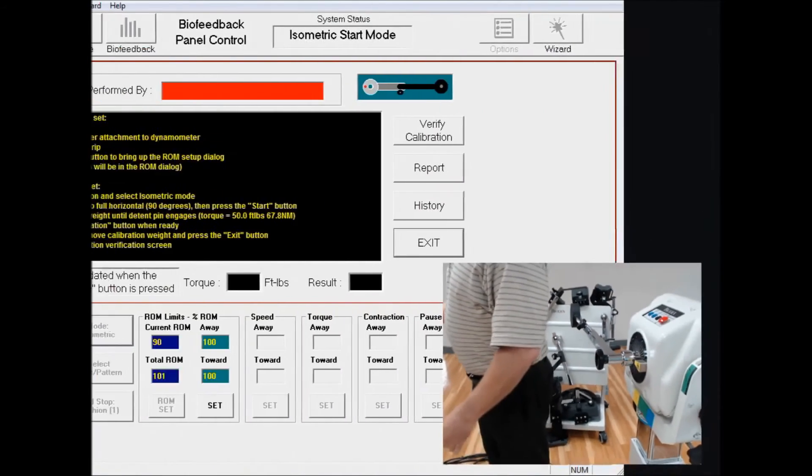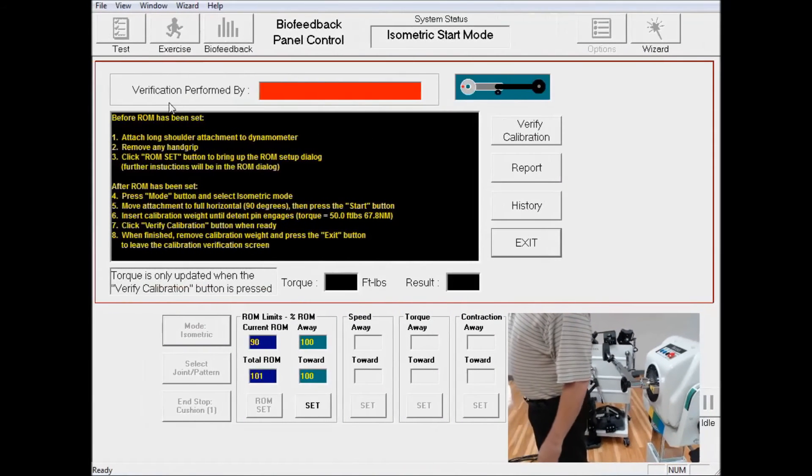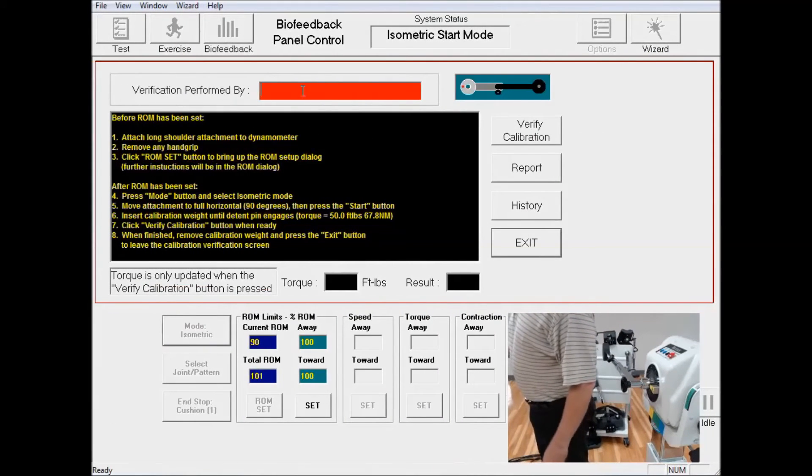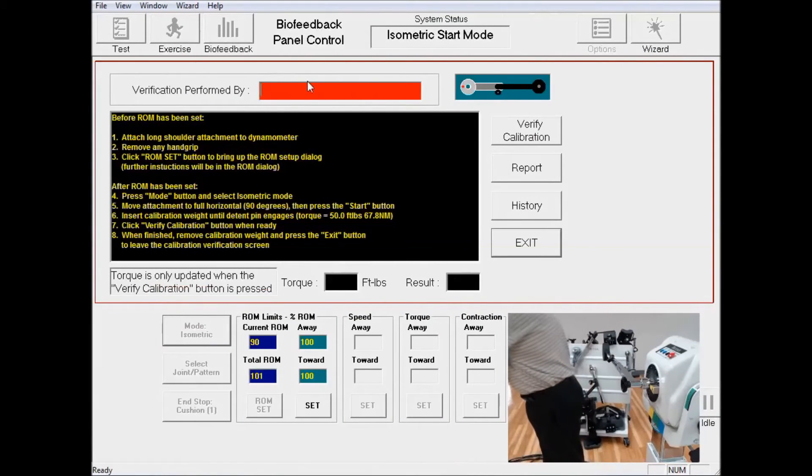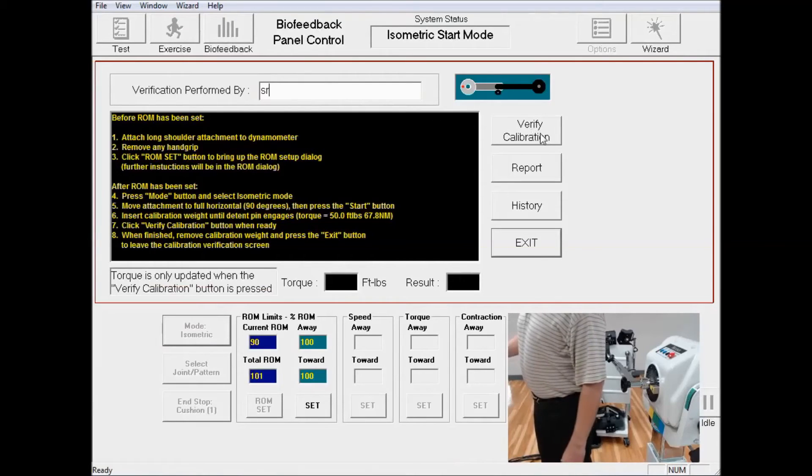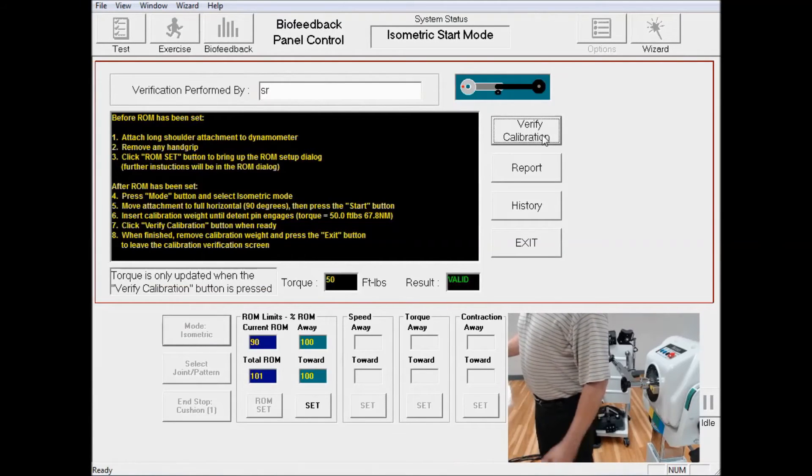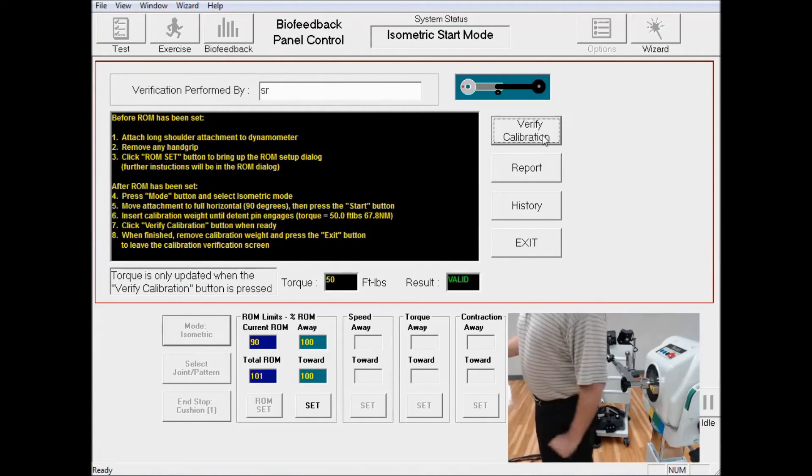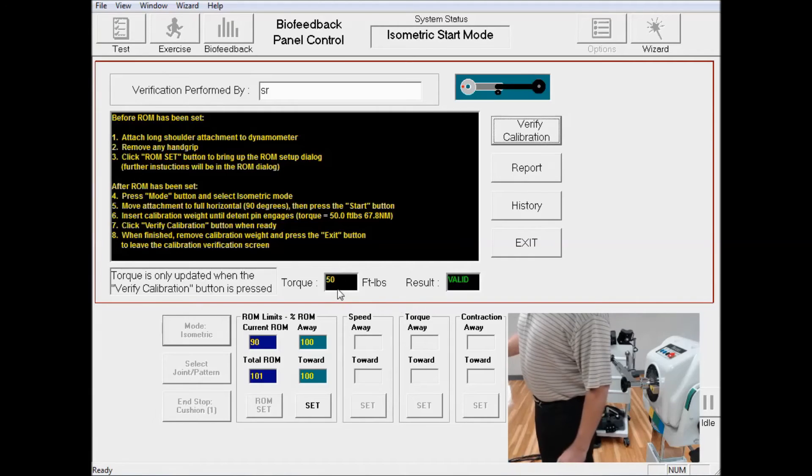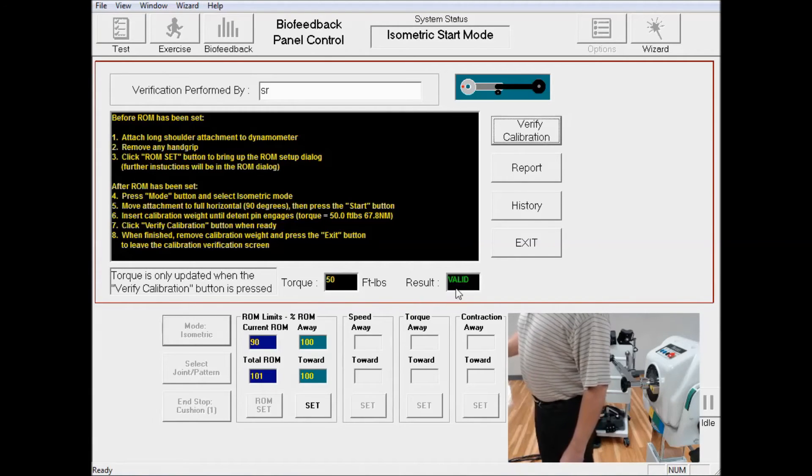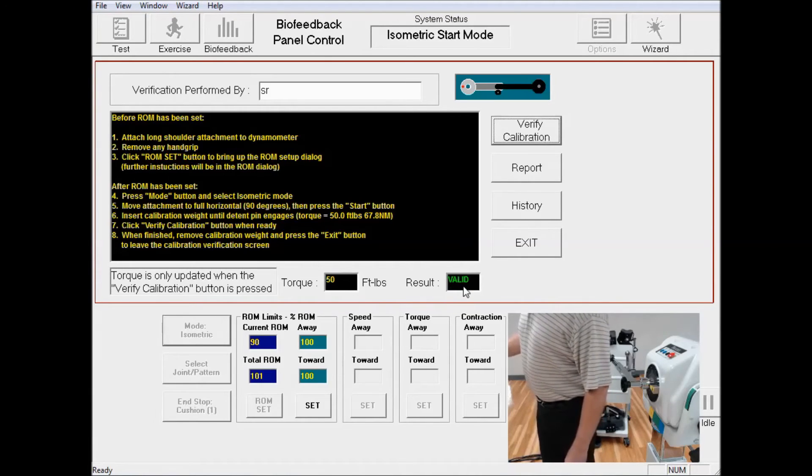At this point, you're going to type in your initials for the calibration and click on Verify Calibration. If everything is okay, you should read 50 foot-pounds and the result should show valid. That's it.